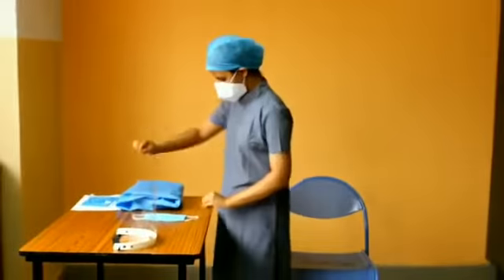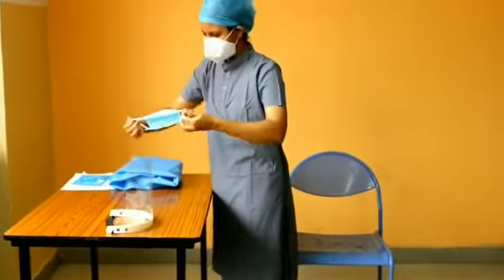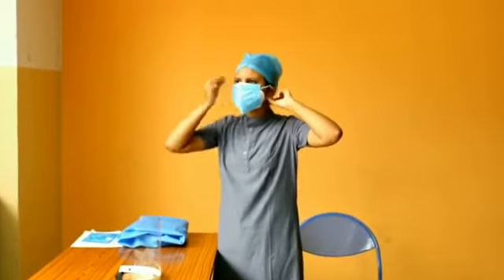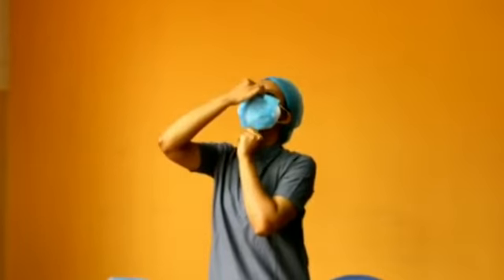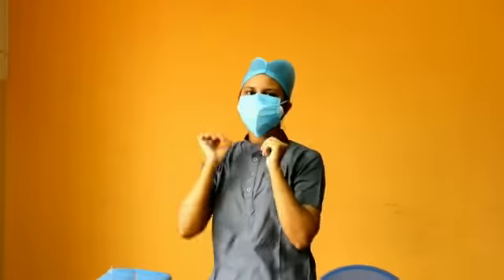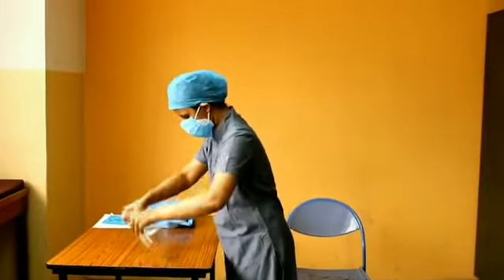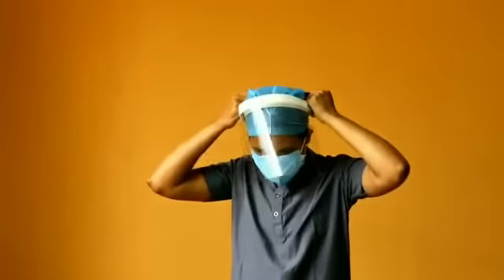Take a mask, hold both sides of the mask string, and place it on the nose. Put it on both ear lobes, pinch the bridge of the nose, and pull it over the chin. The mask must cover the whole nose and chin. Then take a face shield and cover the face completely.